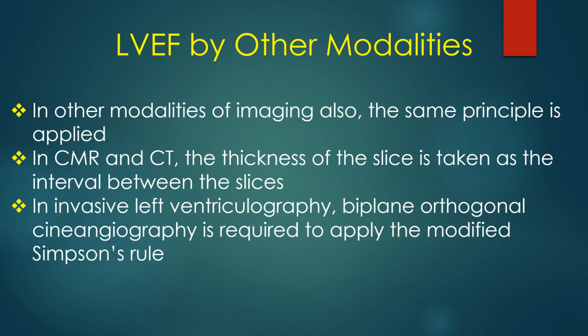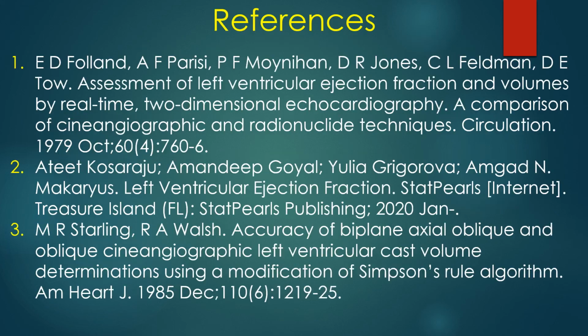In other modalities of imaging also the same principle is applied. In CMR and CT, the thickness of the slice is taken as the interval between the slices. In invasive left ventriculography, biplane orthogonal cine angiography is required to apply the modified Simpson's rule.